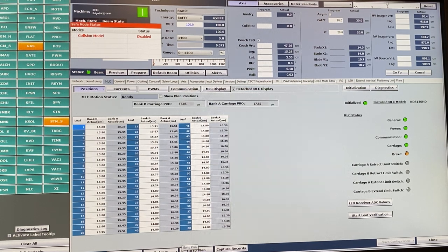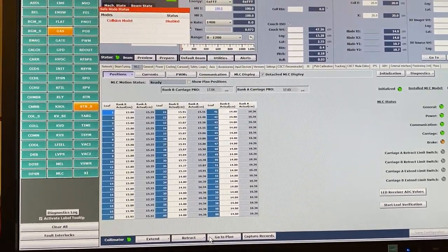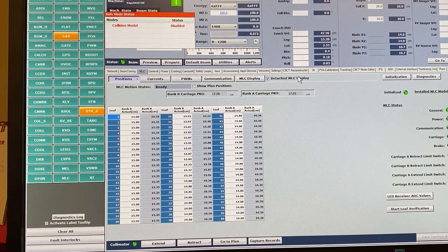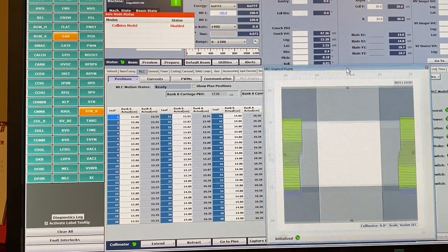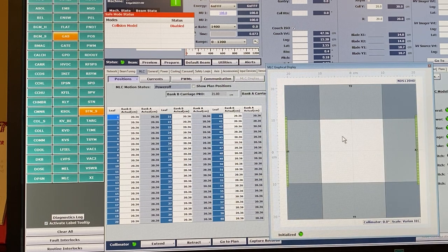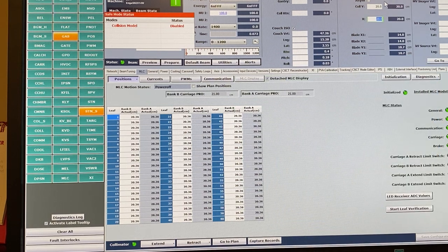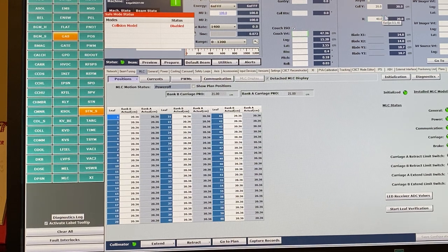We can do similar things with the MLCs — we can retract the MLCs from here as well. This is essentially how we set the field size during monthly QA. For monthly QA you'd set 10 by 10 and retract the MLCs. For the daily tracker you'd set 20 by 20. For the ArcCheck you might set the maximum field size of 40 by 40.